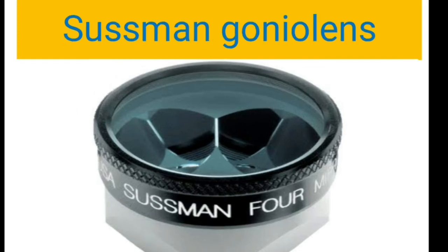So what is the procedure? Just give gentle pressure over the cornea, that is, indent the cornea to some extent. Then there is displacement of the aqueous towards the angles. So if it is just an appositional angle closure, then the angles will open up and you can visualize the angle structures. But if it is firm synechial closure, then you will not be able to visualize the angle structures.